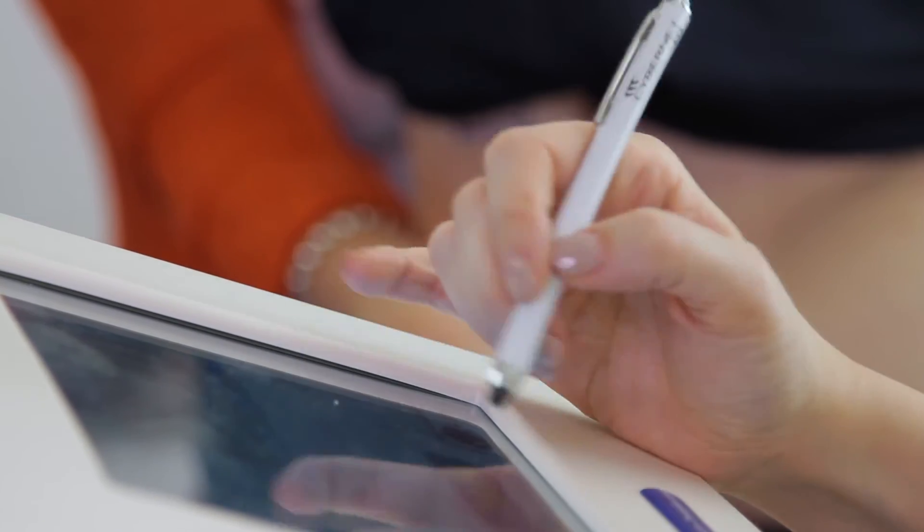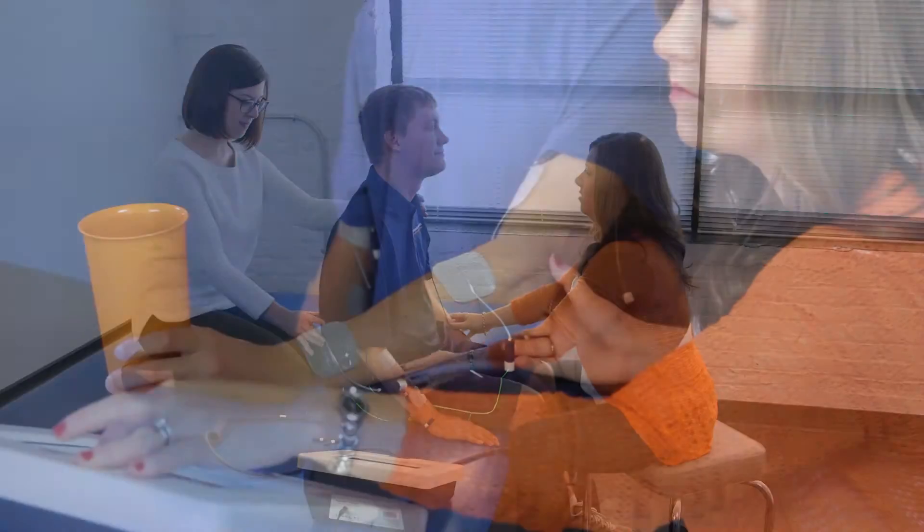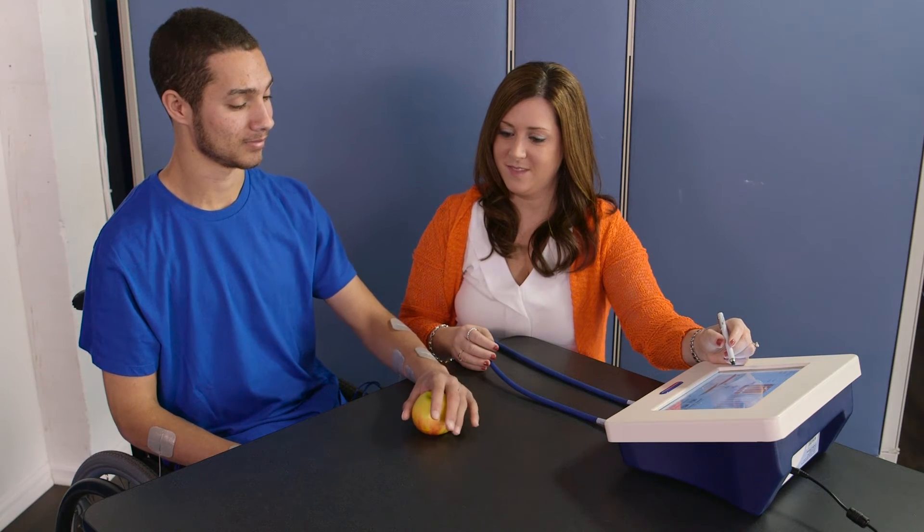In addition, the Stimulation Controller with its intuitive tablet interface can be detached, facilitating unobstructed patient access, unobstructed patient motion, and your own proximity to the tablet during therapy.